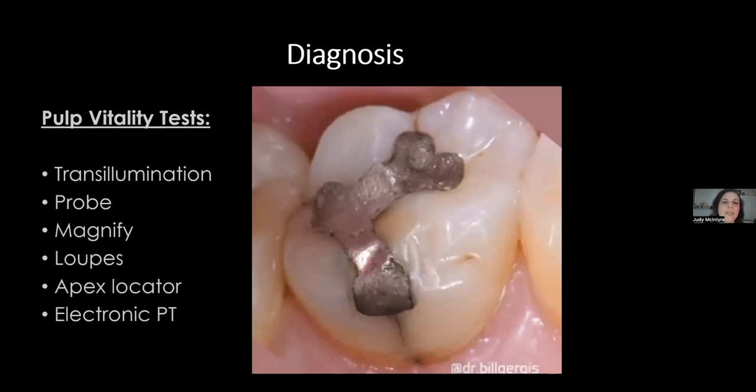So let's back up a little bit. Obviously, I'm an endodontist. So even yesterday, I was referred patients with extreme pain. One of them had a crack. So how do I proceed regarding what teeth can be saved or not? Any patient coming to me in pain or not, I always have to start with a diagnosis, right? And how do I come up with a diagnosis?